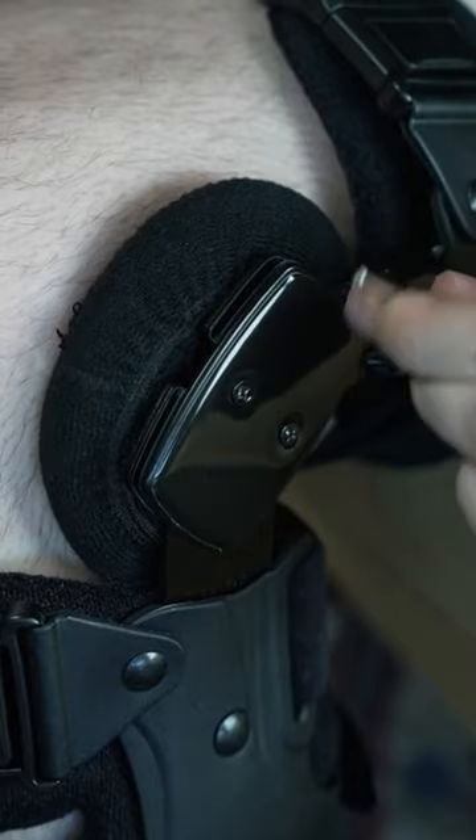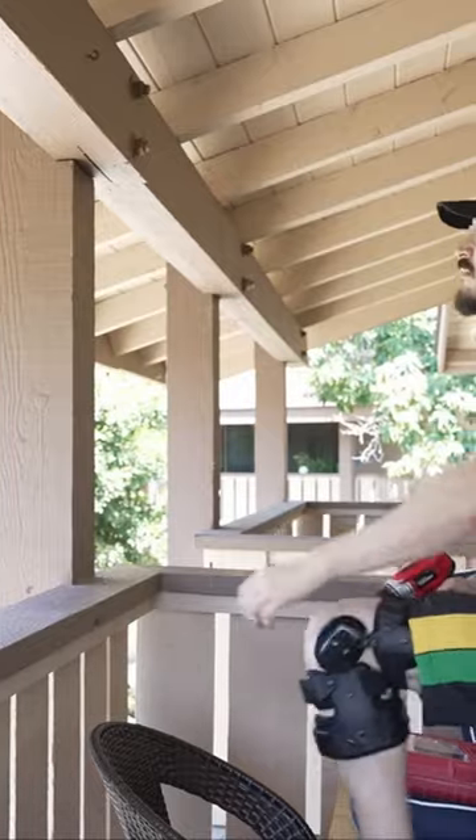Now you can change the varus and valgus angle to relieve pain, and go on with your daily tasks knowing that your knee is protected.